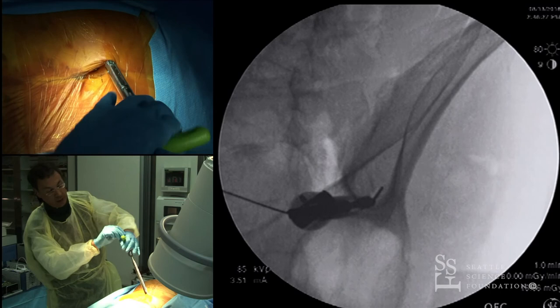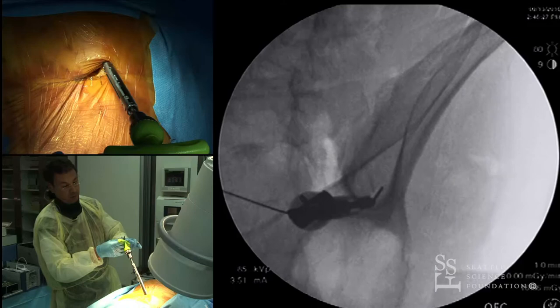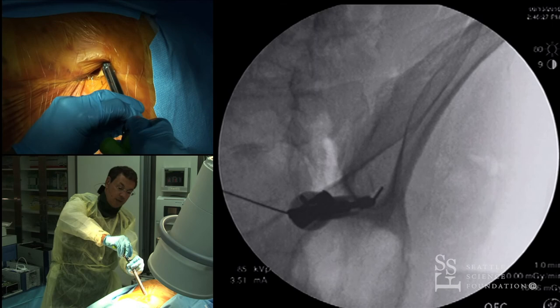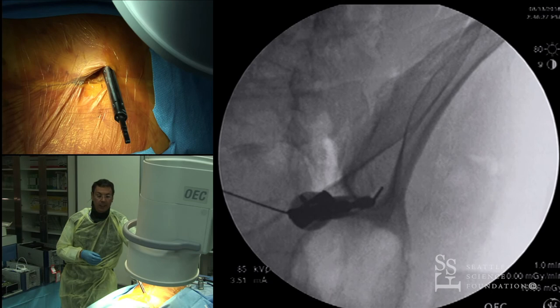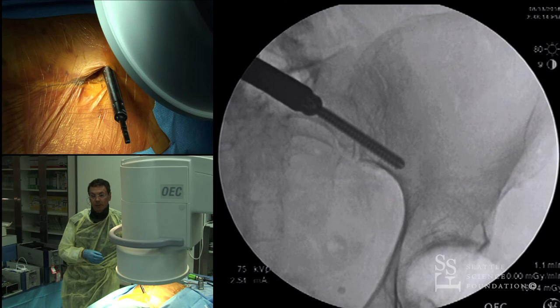One advantage is that since your starting point is just behind the SI joint, the screw heads end up very deep, so you don't have the problem of the head coming out or being too superficial. Take a picture to confirm the position — notice how nicely we are close to the sciatic notch, taking advantage of that cortical bone, and staying inside the teardrop.